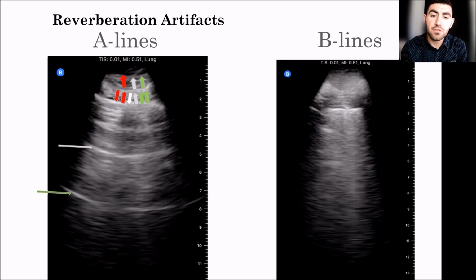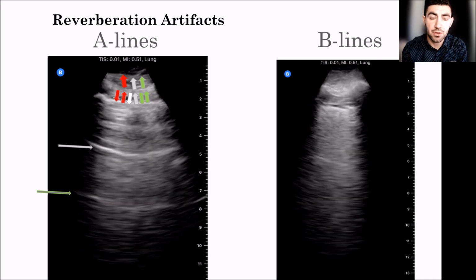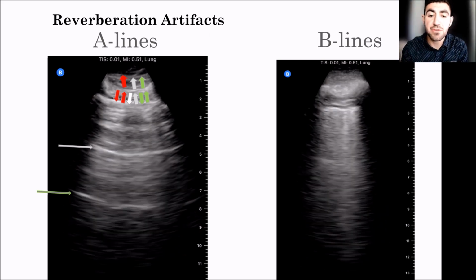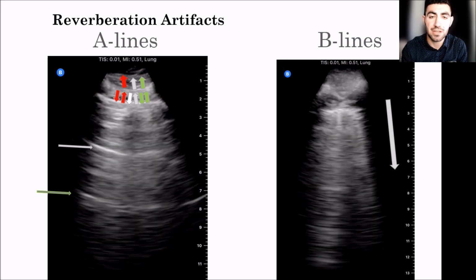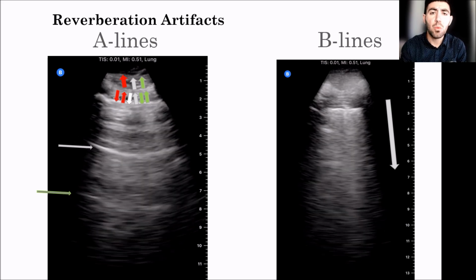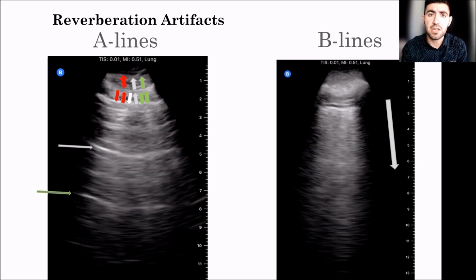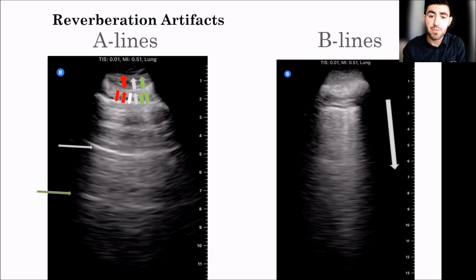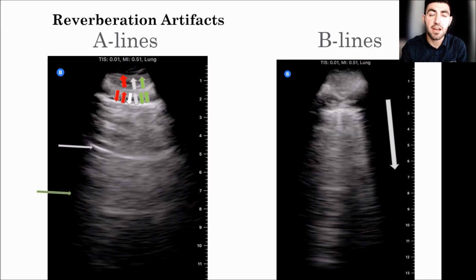And those ultrasound waves are actually able to penetrate between some of the alveolar septa and bounce back and forth between these air-filled structures, and you get this vertical projection from this pleural line. Now, keep in mind, one or two B lines is not really concerning because we can have a little bit of fluid within the fissures, but greater than 3 in any space is concerning for some degree of pathology.